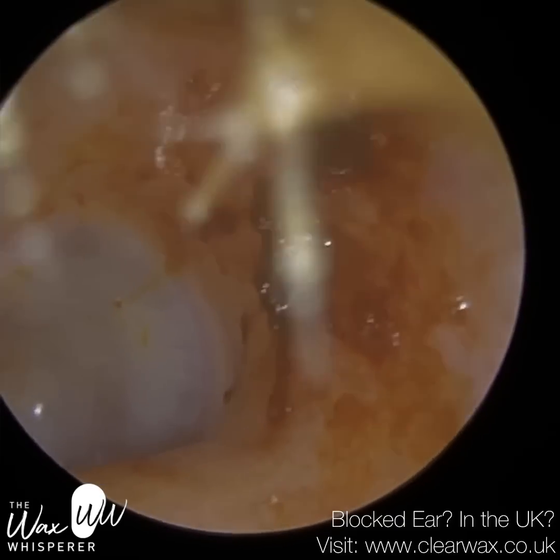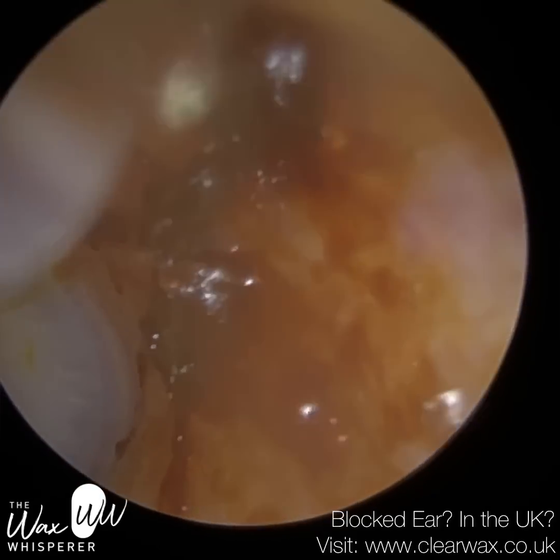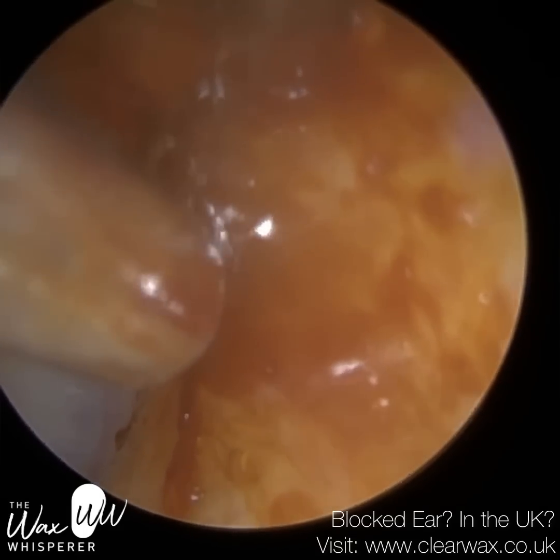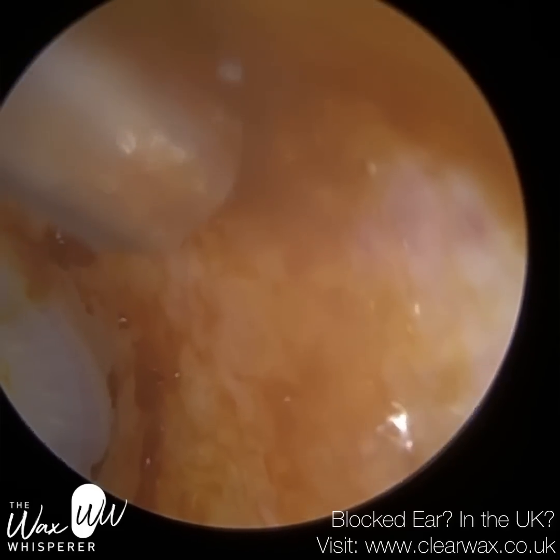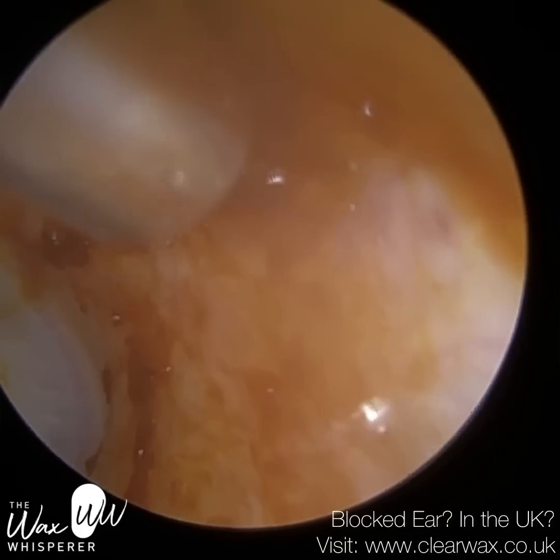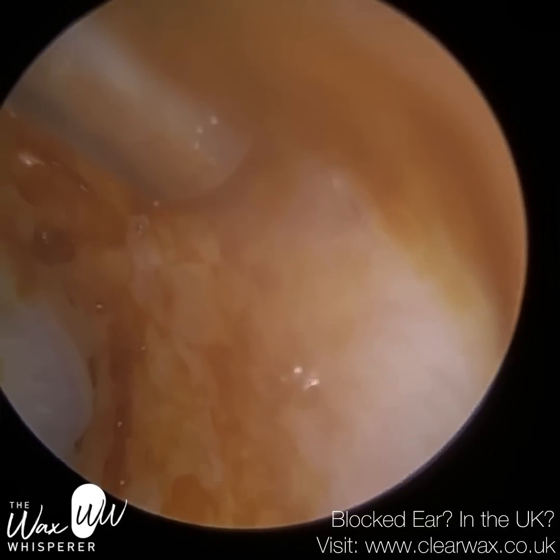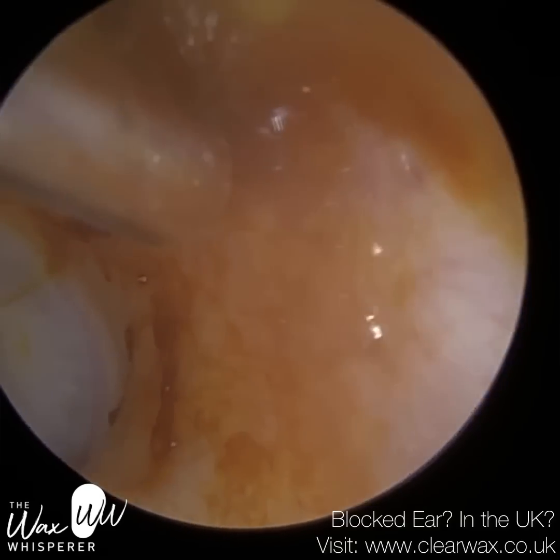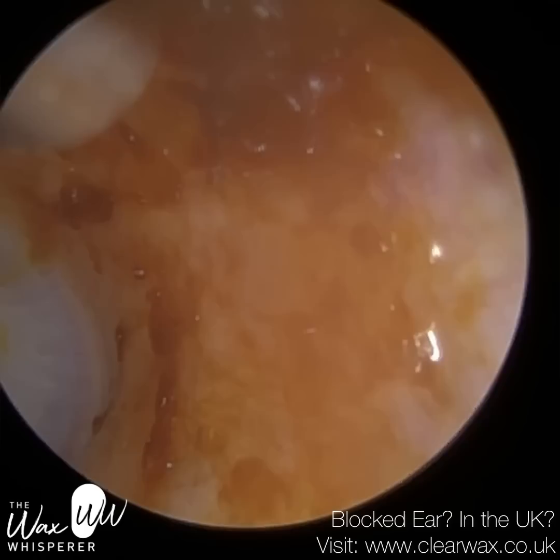I've also developed a grading system based on how occluding the earwax is. So the grading system is purely on how much of the view of the eardrum is obstructed by the earwax, as opposed to symptoms. And the reason why I say that is you can get a patient with just a little bit of earwax, which I assume is not going to cause the patient any symptoms, but they really, really feel the earwax is affecting them. Well, not feel, it is, because they wouldn't be there otherwise.